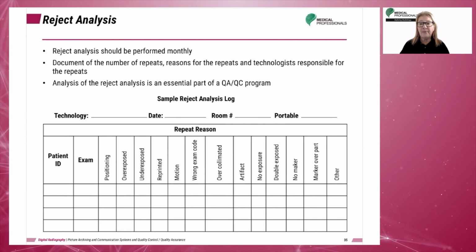Reject or repeat analysis is not new to medical imaging. In film screen imaging, this was a manual process that required a significant amount of time and was usually performed by the lead technologist or manager. Today, this can be accomplished using vendor software.